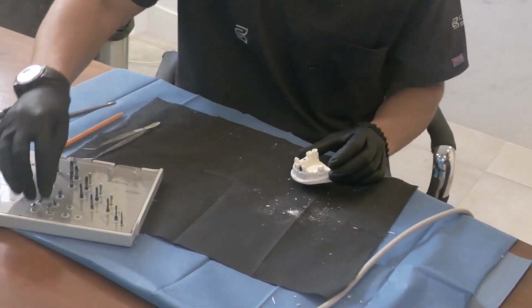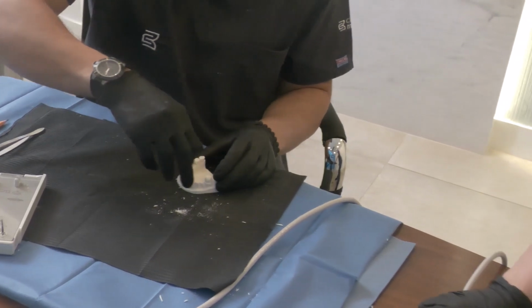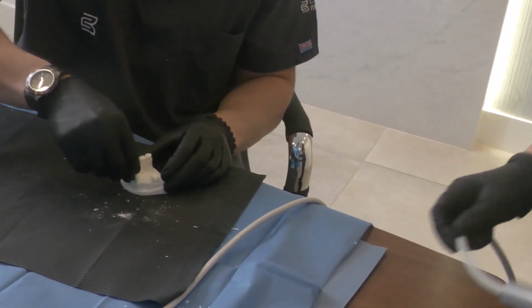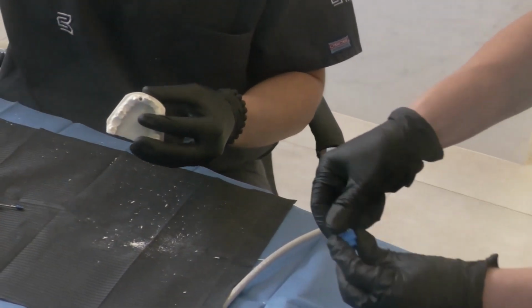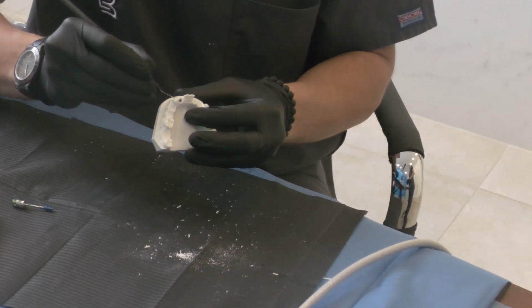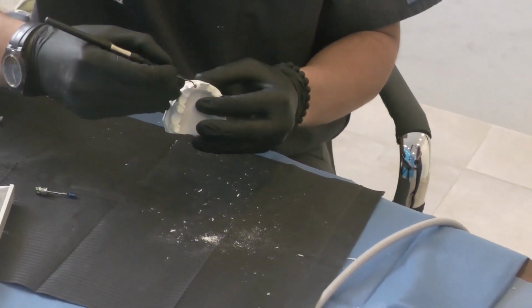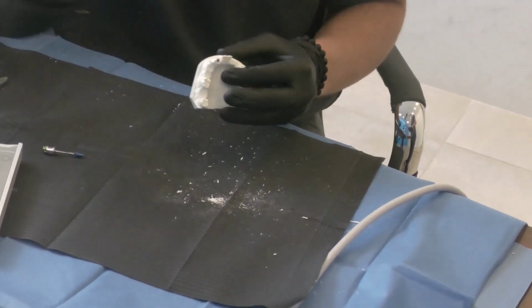And now again, we'll be checking the apicocoronal implant position. We help ourselves with the screwdriver. You can see the ideal position in terms of the buccolingual, having at least 1.5 millimeters, mesiodistally at least 1.5 millimeters, and 1 millimeter sunk into the alveolar bone.